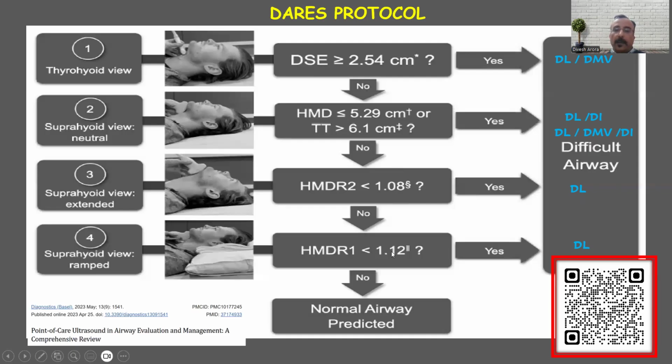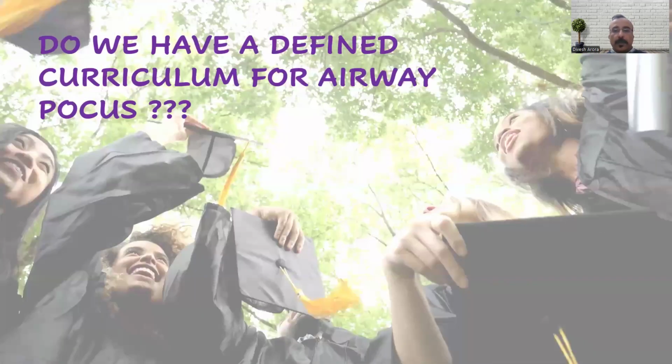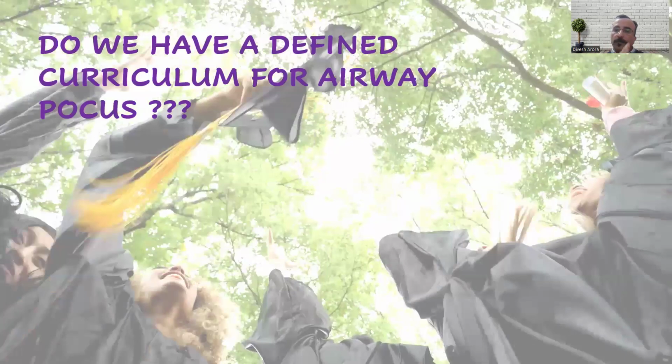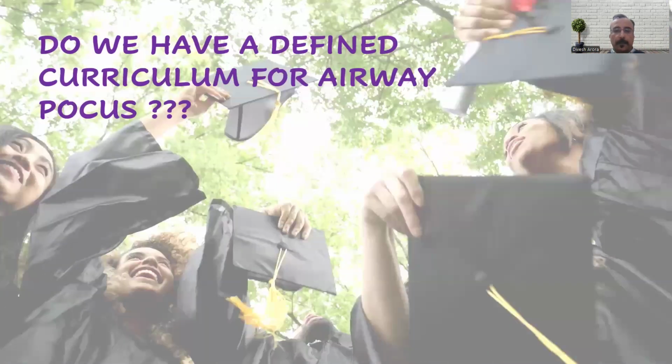If it's less than 1.12, particularly in the ramp position, then it indicates difficult laryngoscopy. So if everything is normal, then it becomes a normal airway predictor. So one can essentially take up a thesis or a study to validate this protocol against the standard measure. So we have studied various views, what are the structures to be identified, and what are the uses for an anesthesiologist in the perioperative period.